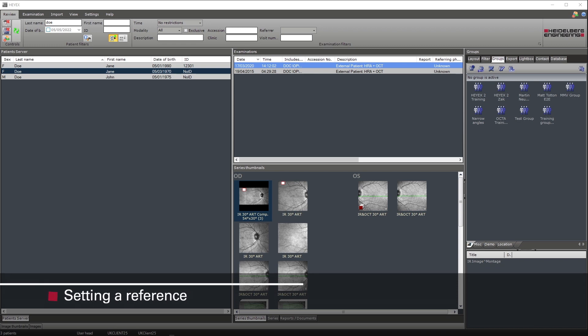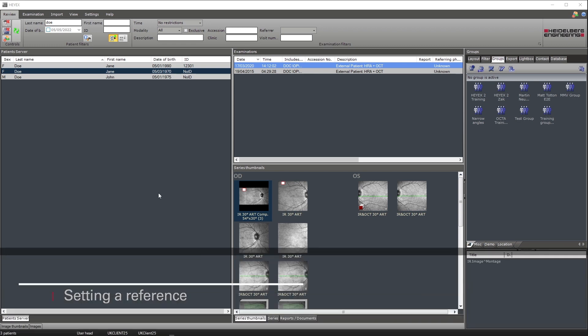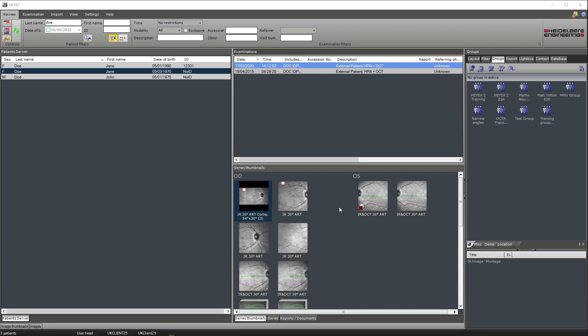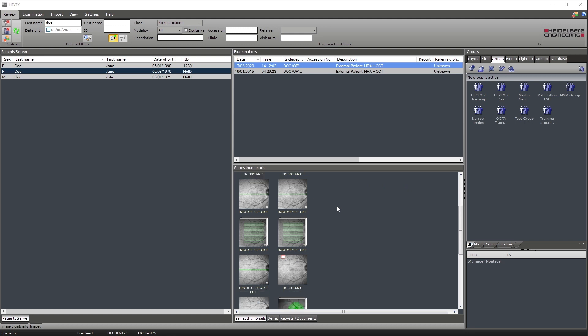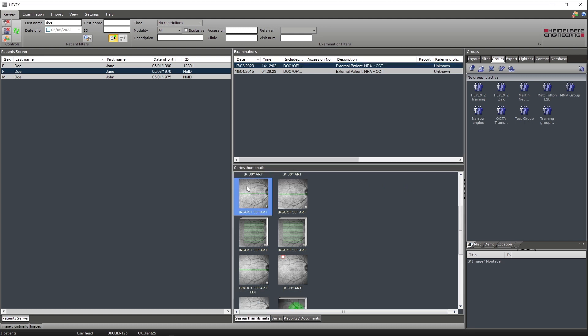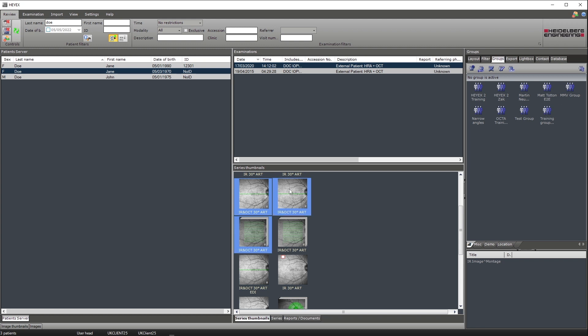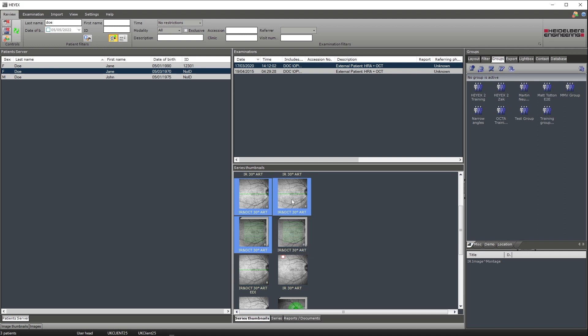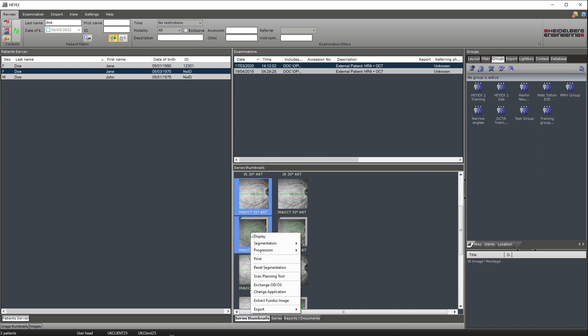To set references within HiX2, select the thumbnail you wish to set a reference, or select multiple by holding down control and clicking on both thumbnails. Once you have highlighted both thumbnails required to set reference, right click, select progression, and then set reference.